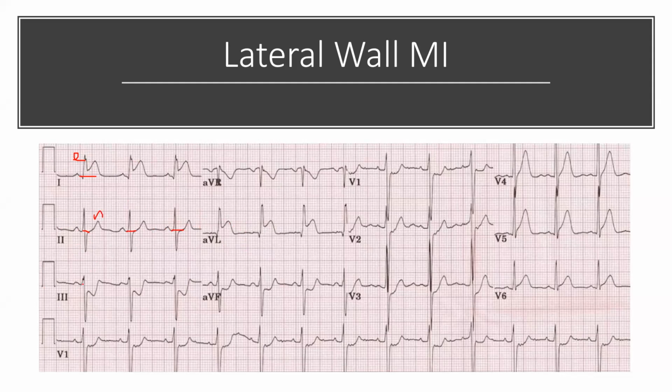All right, how about lead 3? Depressed. How about AVL? Elevated. And how about AVF? Depressed. Okay.